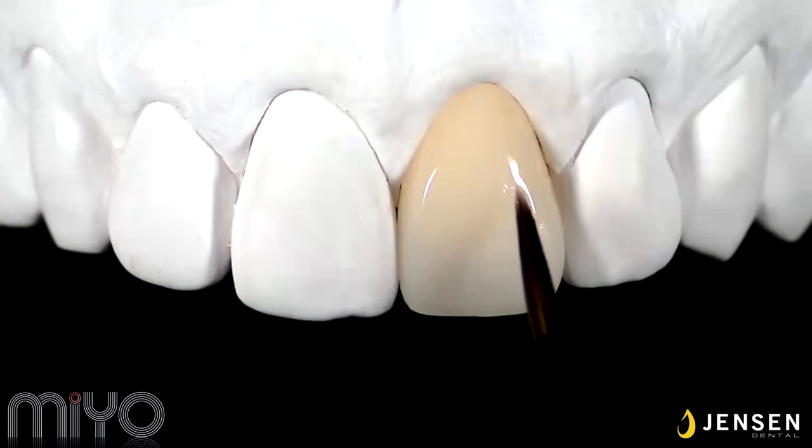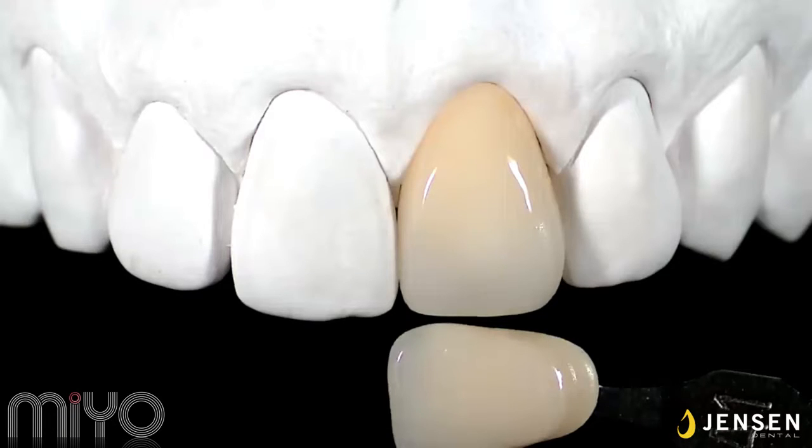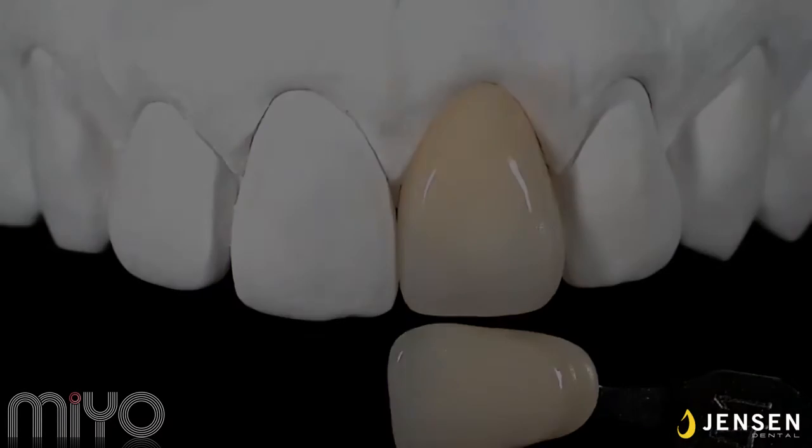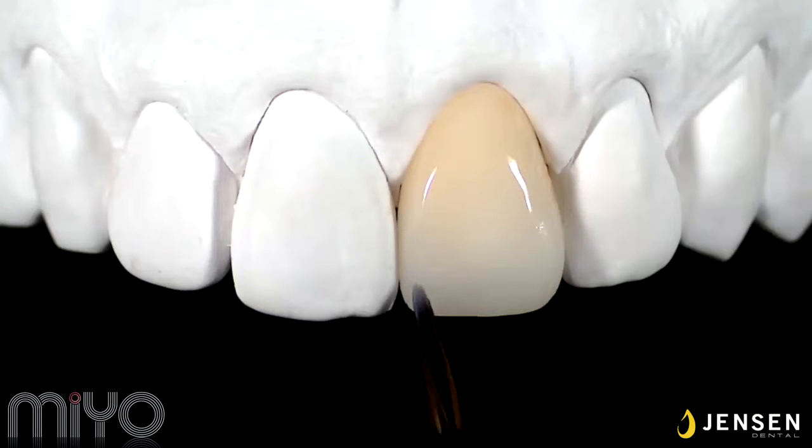Here's a quick tip on shade taking. When you check for shade using tabs, make sure you look from all angles of the tab to avoid optical illusions for the target shade. Now translucent storm is applied for the incisal 1/3.